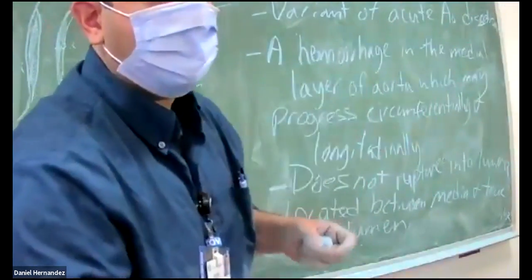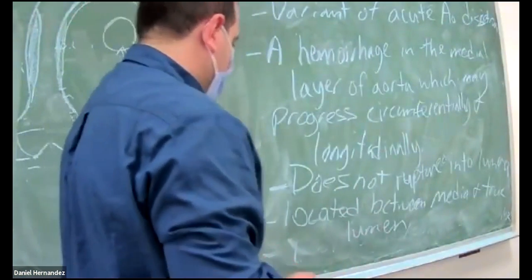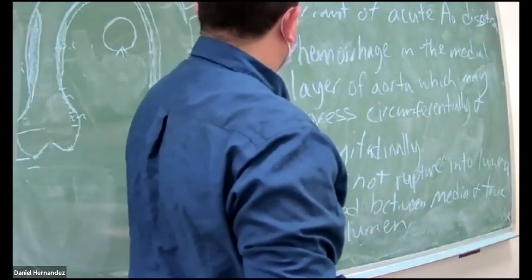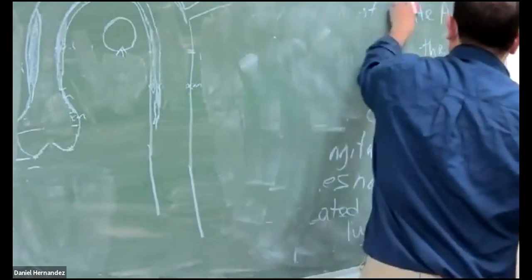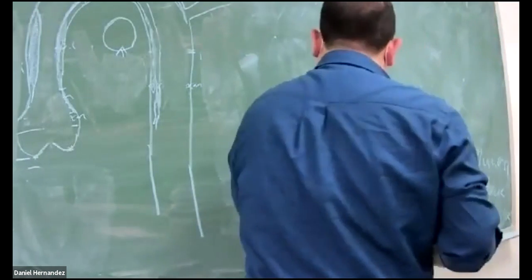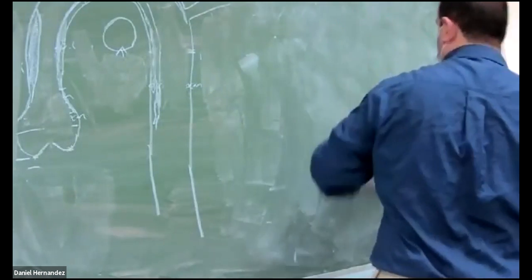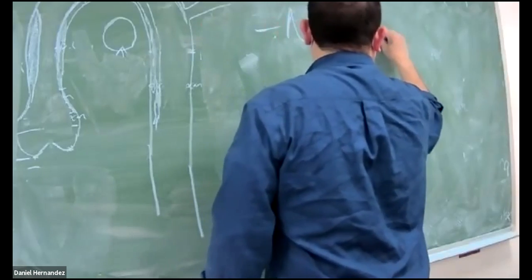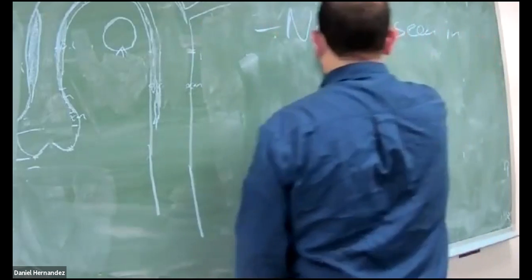And there is no flow within the hematoma.